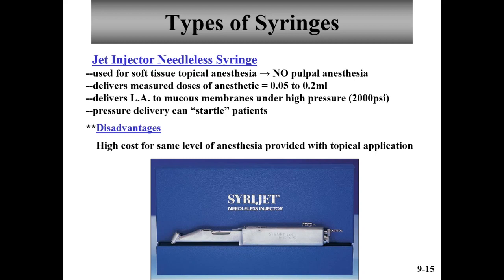The reason it's an expensive piece of equipment, and the reason it's really not used, is it only provides soft tissue anesthesia. So it doesn't do anything more than topical applied with a cotton tip applicator does. Although having said that, occasionally you can get anesthesia in children on the maxilla.